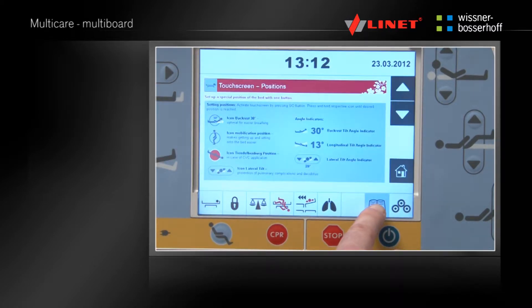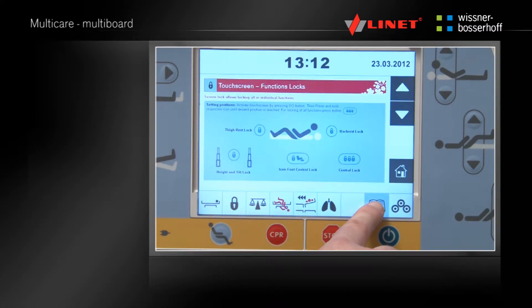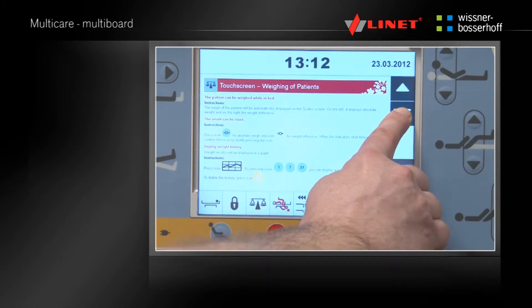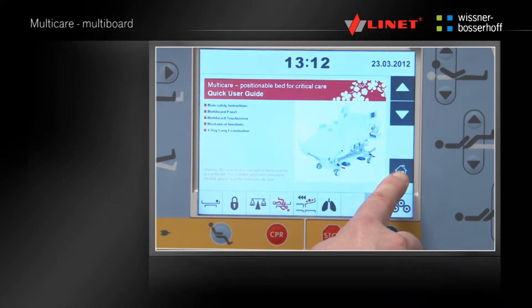By pressing the book icon, a quick guide of the MultiCare is displayed. Find specific topics by using the arrows. Press the book icon on the functions screen to get a quick guide for the specific function. Go to the first page by pressing the home button.